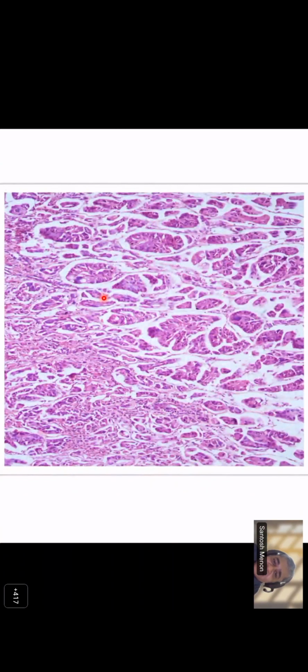They are more in small nests and aggregates, I would say. Yes. Verma sir, you want to correct them in their description? Anything? Yeah, perfect. As you very rightly said, you got these spaces with multiple of these small papillary structures. But this particular form of carcinoma is often associated with lymphovascular invasion. Parul is absolutely right that what you're seeing here is not lymphovascular invasion, but if you look hard enough, you often find lymphovascular invasion too.